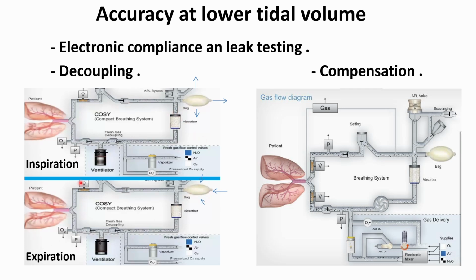During expiration this bag will be deflated because this valve is open, so the pressure here will be relieved, allowing the bag to deflate.